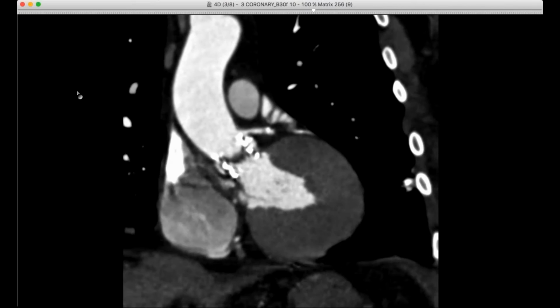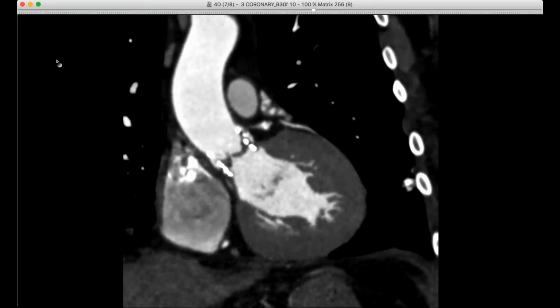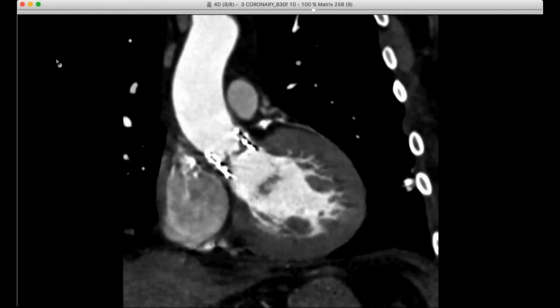So there was a New England Journal article on this talking about the incidence of thrombus, and it's associated with missized valves or missized apparatus. So there's a study that came out last year that looked at a very high incidence of this occurring, and they said it occurred mostly in their patients where they were between valve sizes and chose one, so they concluded that it was a missized valve. But there is some data on this, and it's unfortunately more common than we think. Yeah, I suspect it is more. I mean, we've seen over the last few weeks at least a couple of cases here. So I'll have to go back and look at that article.